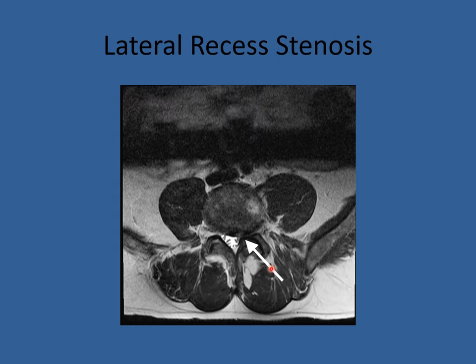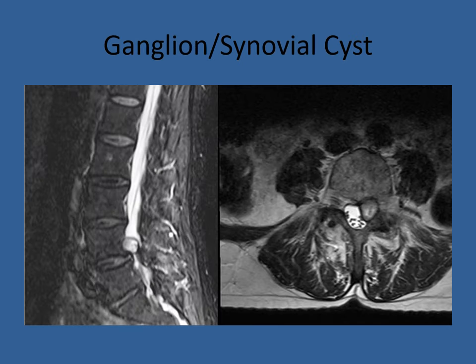Lateral recess stenosis can occur even without a crescent sign. There is a degenerative spur that has grown out into the facet. The right side is normal, while the left side is narrowed — and that is lateral recess stenosis.